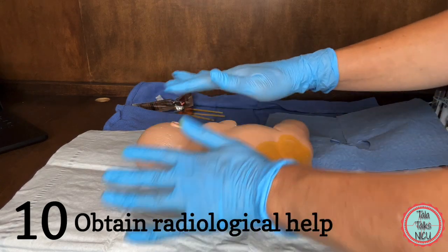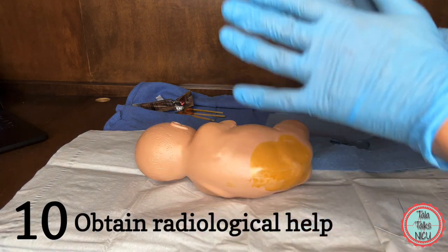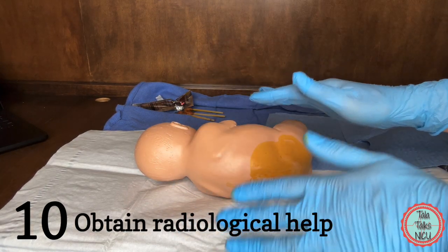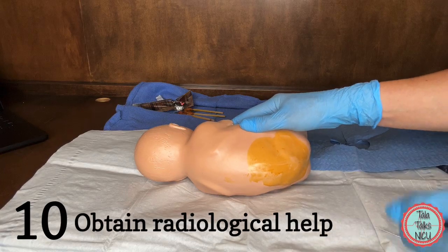Ten: you've tried everything and you still really need this tap. Sometimes we just stop and choose to treat the baby for 21 days for meningitis if we can't get it. But if you still really need it, you can get help with fluoroscopy or maybe with an ultrasound to guide you.